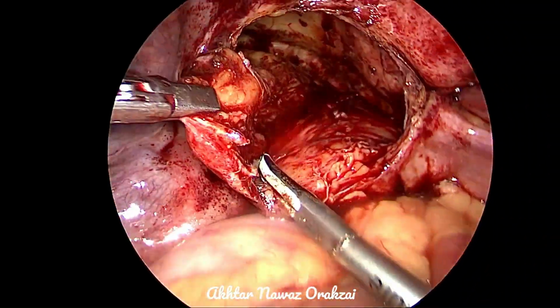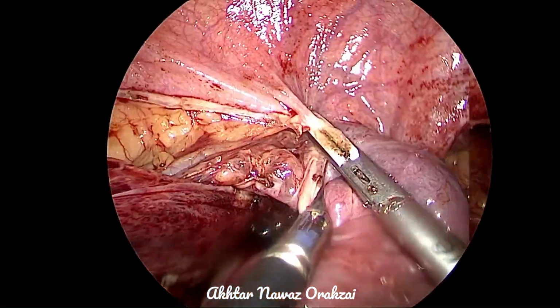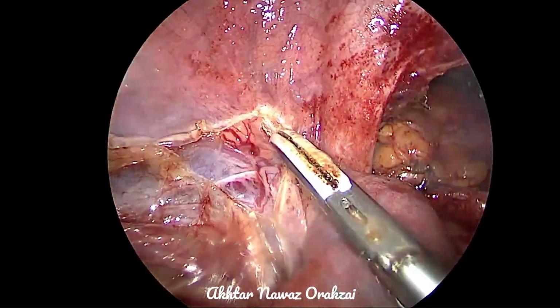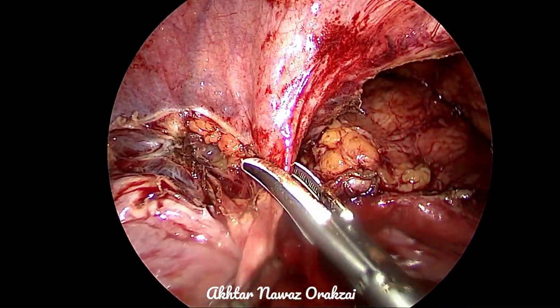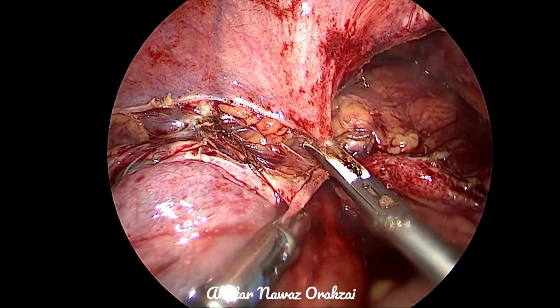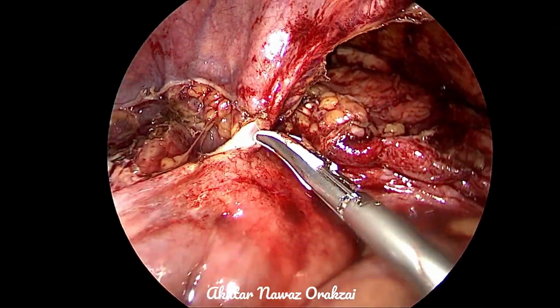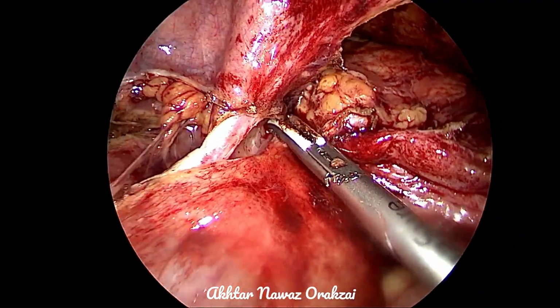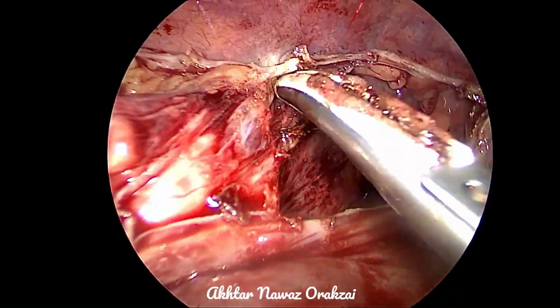So we are checking here whether we can easily come. This fallopian tube and ovarian complex is preventing the bladder from being mobilized up to the psoas muscle. So we take down the peritoneal covering laterally. This is the round ligament, the round ligament of the uterus.